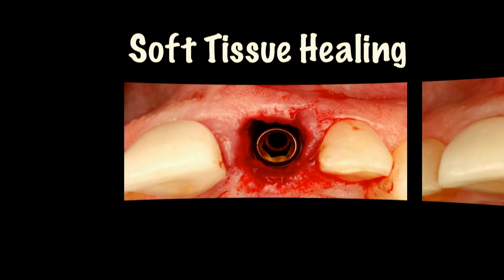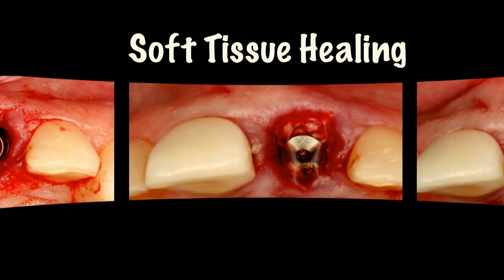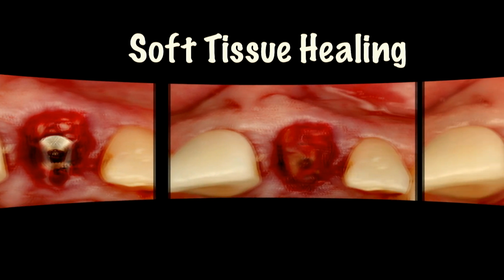We know that the soft tissue migrates over that site at about 1 millimeter a day, and so we can do that. Other cases, we do feel more comfortable, we'll place healing abutments, but you can see as soon as we get that tooth out, what happens to that buccal plate? It collapses because we don't have support. So we can go ahead, place our immediate, even place a healing abutment. We have our bone graft material to fill up that defect.